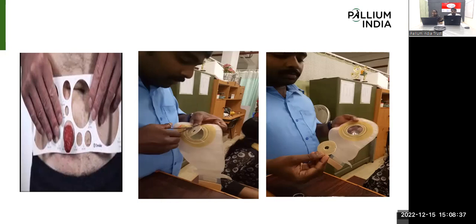Then, according to the size, we need to cut by using curved scissors. We recommend curved scissors because it's a little bit easier to cut. Sharp edges in the cutting area can be avoided by using these curved scissors. We can use them for cutting and preparing the stomal opening for the faceplate.